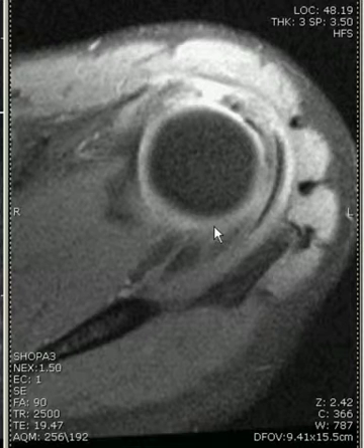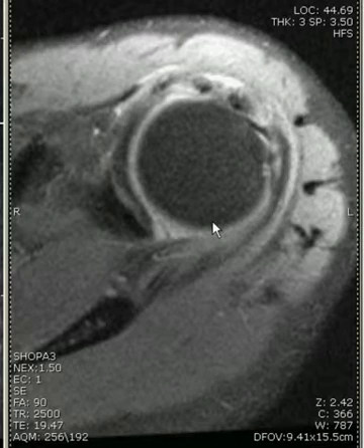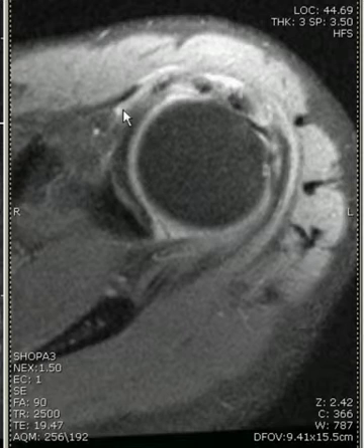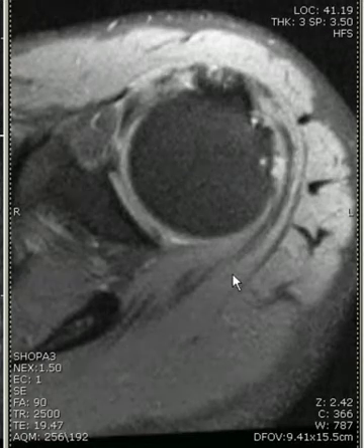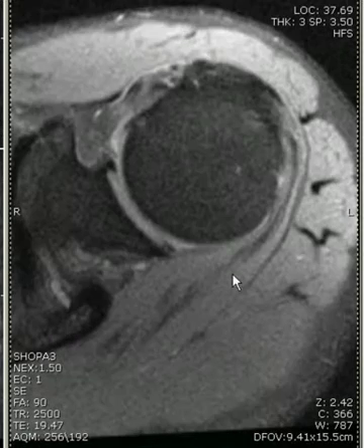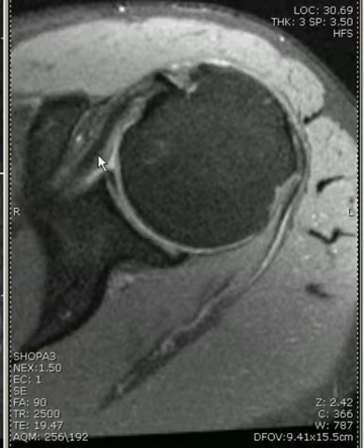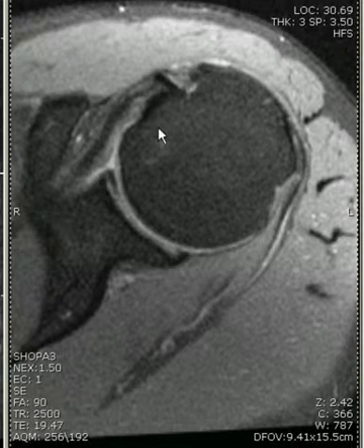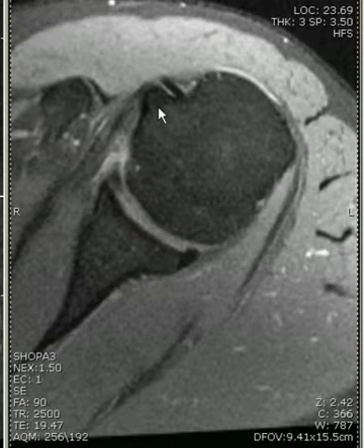It's important to look at the abnormalities in all of the planes. As we move more inferiorly, we can see the biceps tendon attachment to the superior portion of the labrum. More inferiorly, we can see the subscapularis tendon with its normal attachment to the lesser tuberosity.